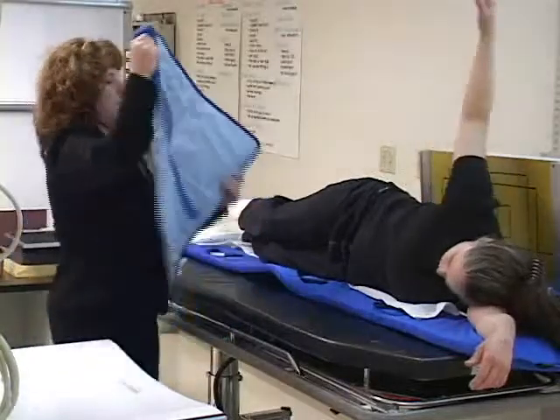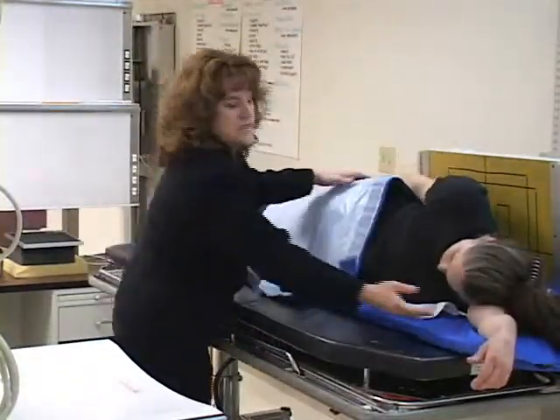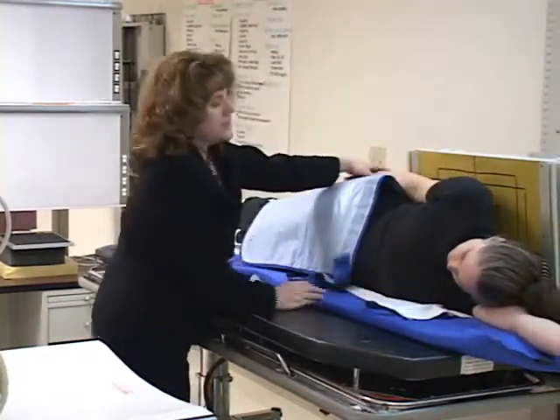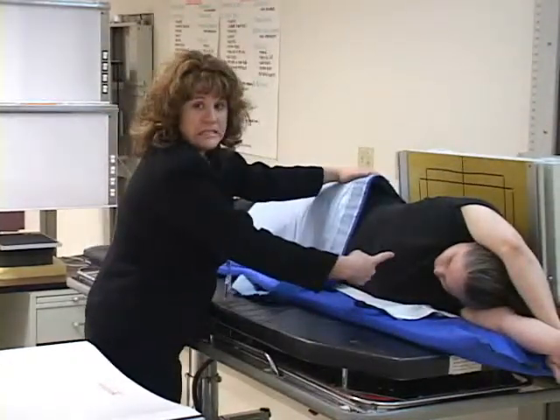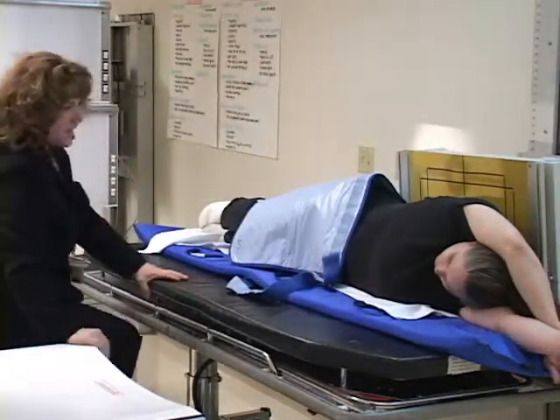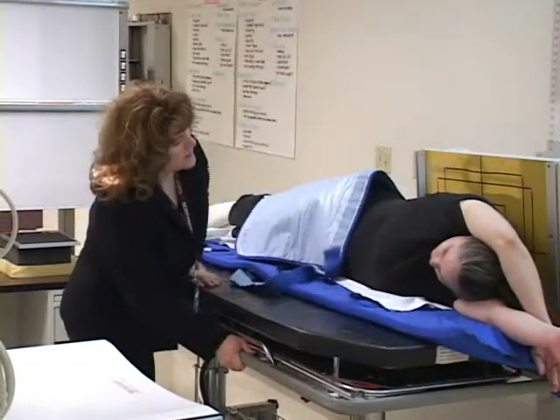I'm going to go ahead and shield her. Okay. This hand needs to be up above. I want her to be as lateral as I can. This arm can either be up or down. Up actually works better. And I'm going to enter about T7. Okay. So again, I'm going to spend some time tweaking my gurney to get her to where I'm entering about T7.